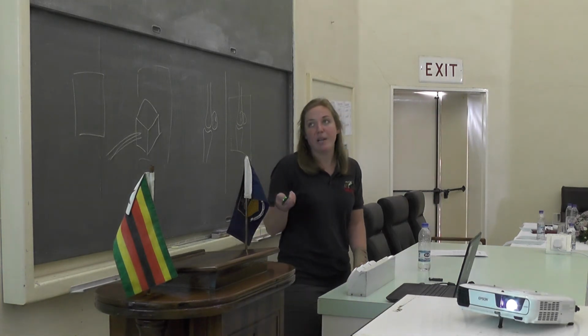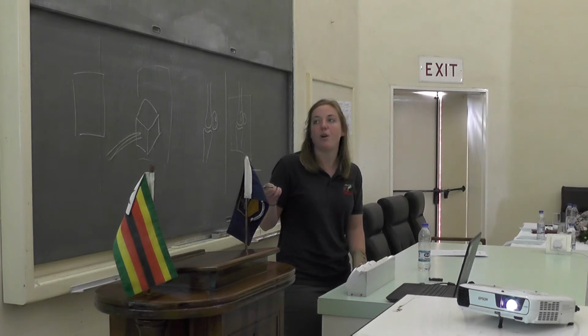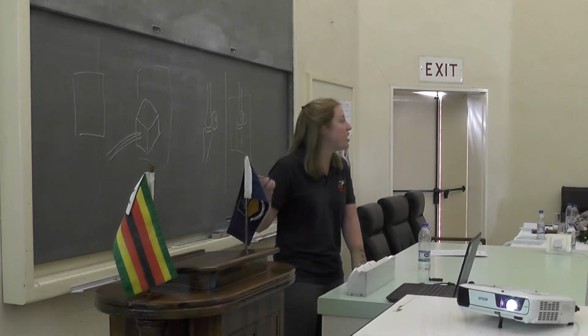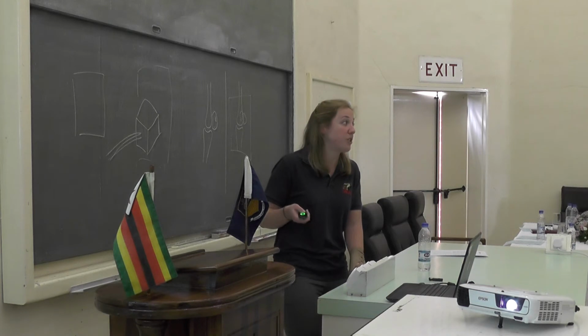And again, the DLPMO and the DMPLO are just rotating in between those two standard views, and you can see how you highlight one and the other one is superimposed, and the opposite view would highlight the other one. The sesamoids are just an easy example to explain, but you obviously highlight the whole other component. You highlight this bit of the joint. What if I have a little chip here hiding away that I couldn't spot in any other projection, for example? So it applies to the whole structure. And the same with the other one.